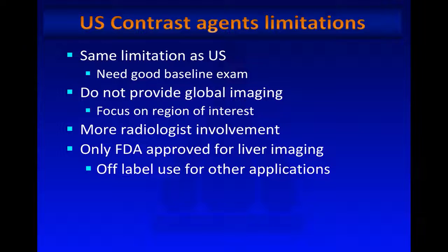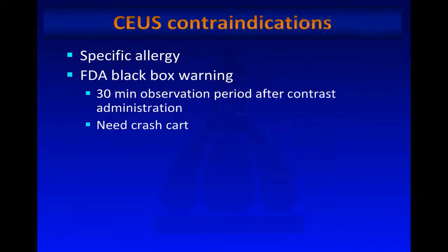It requires more radiologist involvement. Usually it's a 2-people procedure. There is a sonographer who scans, and a radiologist to inject. And it is only FDA approved for liver imaging. However, it can be used off-label, and many of us have used this off-label for other applications.